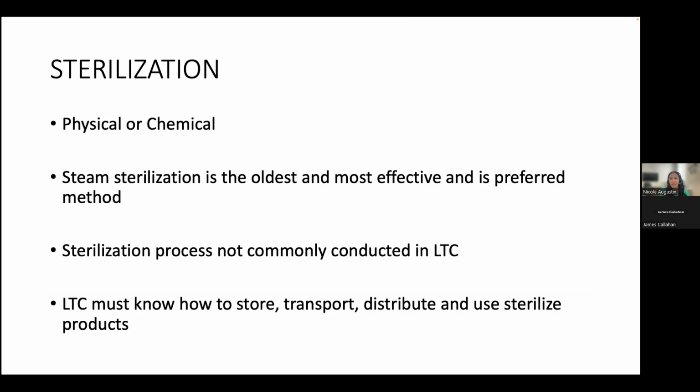Sterilization, however, is not commonly conducted in long-term care. And even though it's not common in long-term care, there are sterilized products used in LTCs. LTCs must know how to store, transport, distribute, and use sterilized products. It's basically a matter of whether or not staff know how to use sterilized products or how to dispose of them appropriately if they have to be sent out. An example of sterile products that are commonly used in long-term care are your Foley catheters and some wound dressings.